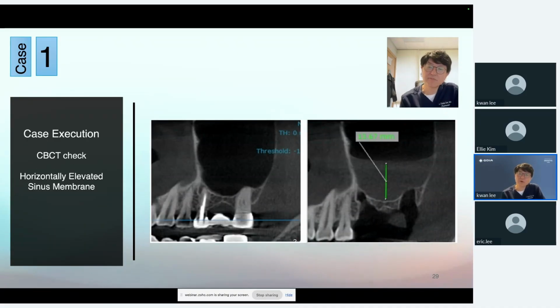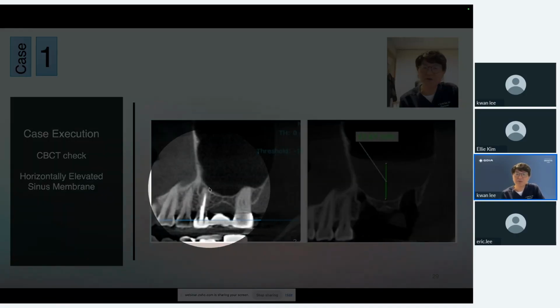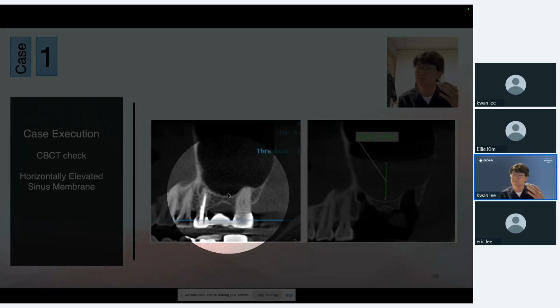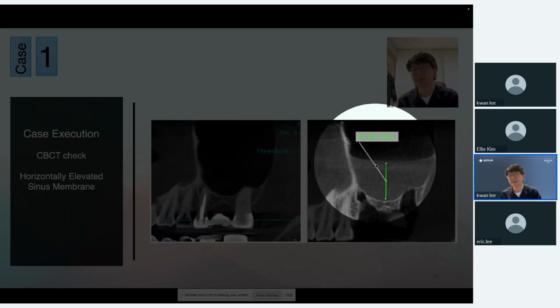Before, my sinus floor was very limited, maybe about 2 millimeters, so I would have to do the lateral sinus case. The lateral sinus case is the only way, as far as I know, that can elevate the Schneiderian membrane way up, like 8 or 10 millimeters high. Crestally, you can try. If you are consistently successful, then I'm going to pick your brain and you can teach me. But crestally, that's very unstable. But with this method, look at this one.